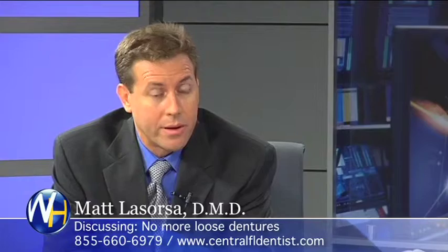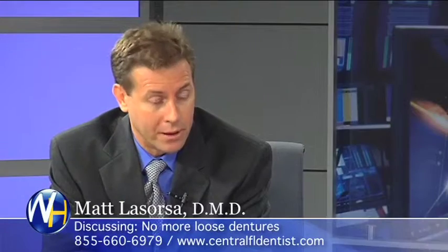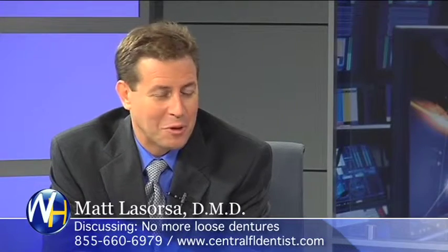Interesting. So the bone just grabs onto these implants? The mini implants are held in by the torque of the screw. So it's like screwed into the bone? Yes. Oh, so they're ready to go right then and there. They're immediately loaded, yes. And, I mean, does that worry you, though, a little bit that they're out eating steak after the procedure? No, not at all. That's what I want them to do.